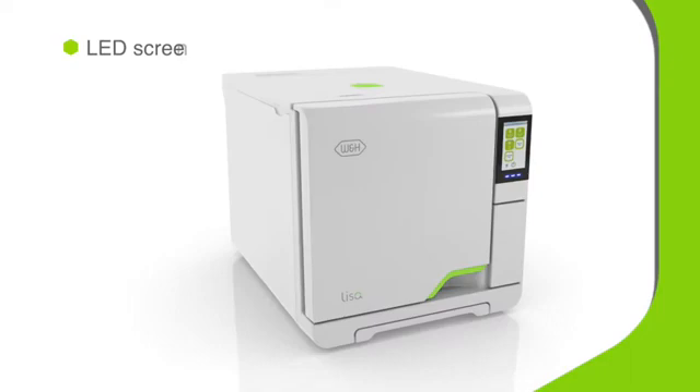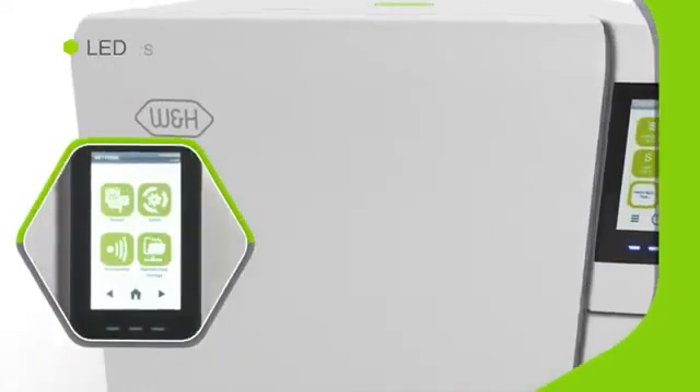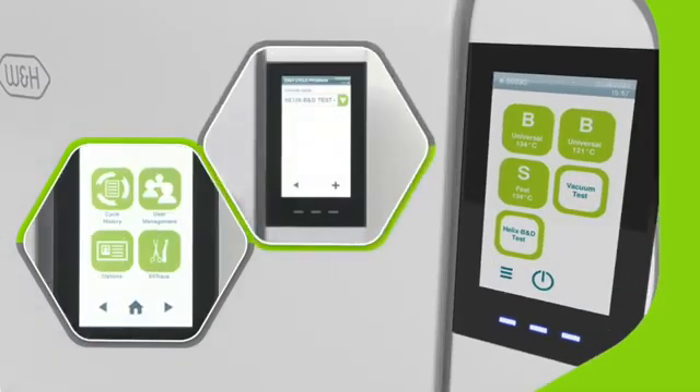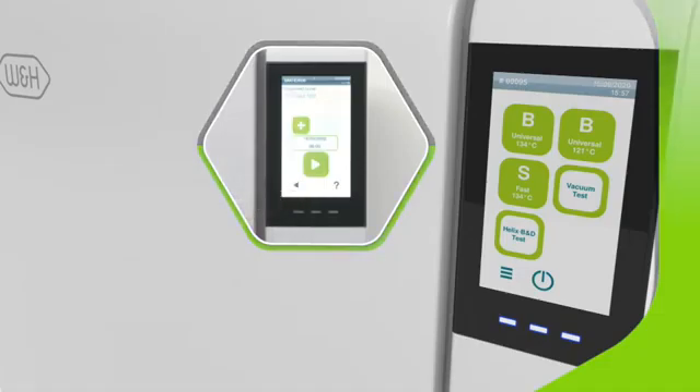The sixth generation Lisa has a crystal-clear touchscreen with an enhanced and user-friendly menu layout. Configuring Lisa to your individual requirements is simple. Want to start a new cycle or schedule daily tests outside surgery opening hours? Tap and it's done.